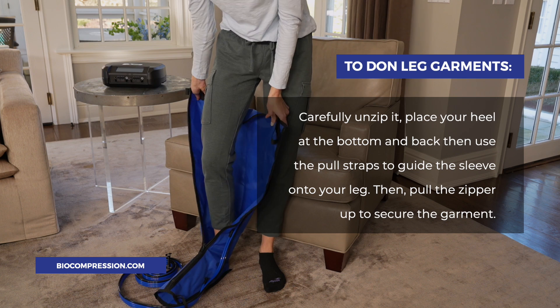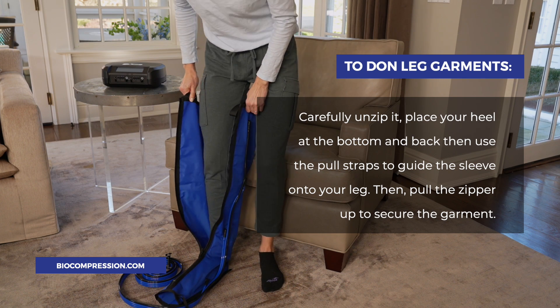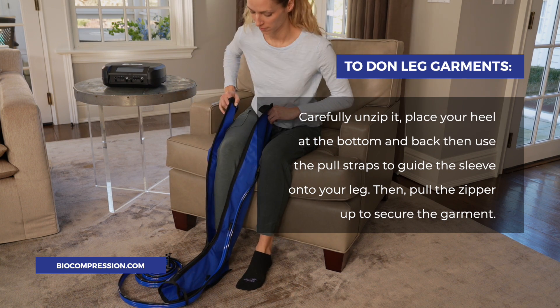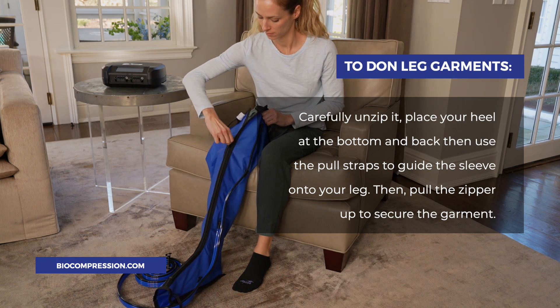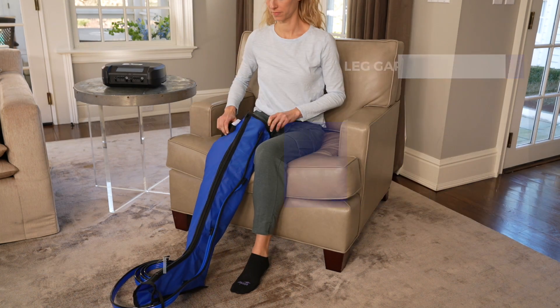To don leg garments, carefully unzip it. Place your heel at the bottom and back and use the pull-up straps to guide the sleeve onto your leg. Then pull the zipper up to secure the garment.